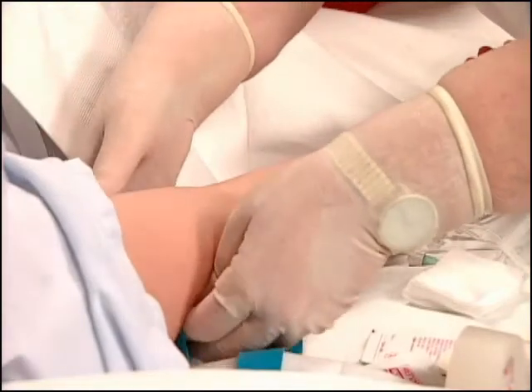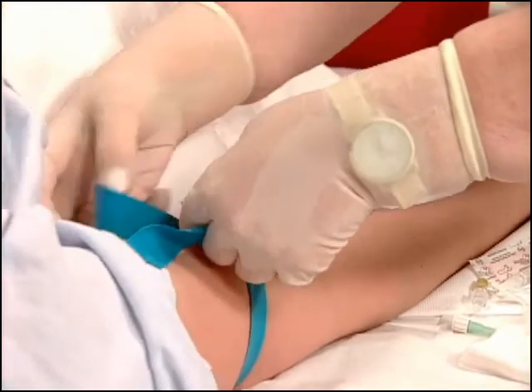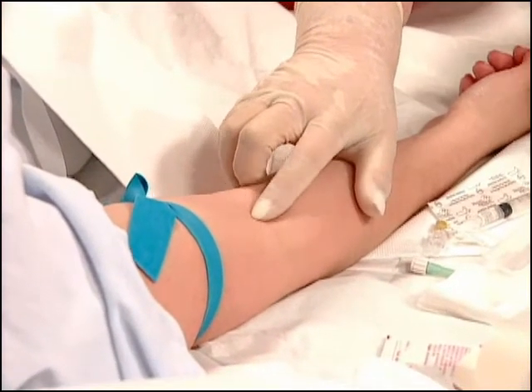Apply the constricting band 10 to 15 centimeters or 4 to 6 inches above the chosen insertion site. When the vessel engorges, palpate it for straightness and sponginess. Then begin the cleansing procedure.